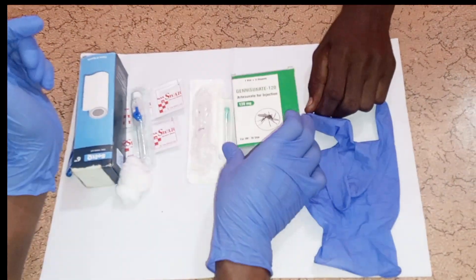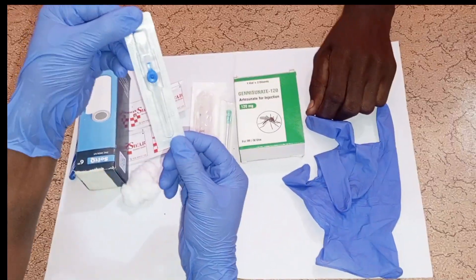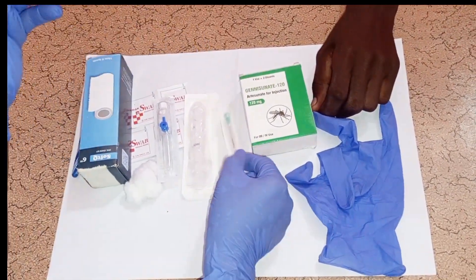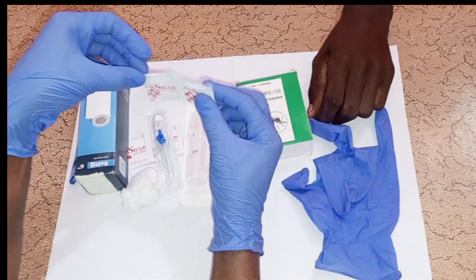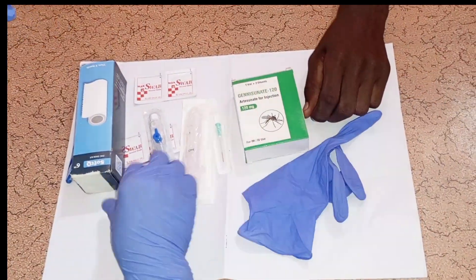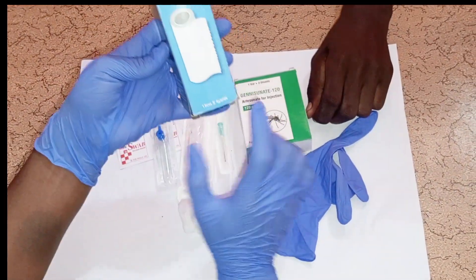Before you start, make sure you gather all the supplies you require. You will need a cannula, a syringe to reconstitute the drug, and a 21-gauge needle. You will need alcohol swabs to clean the vial or the vein, disposable gloves to use as a tourniquet, and cotton wool to apply pressure on the injection site.